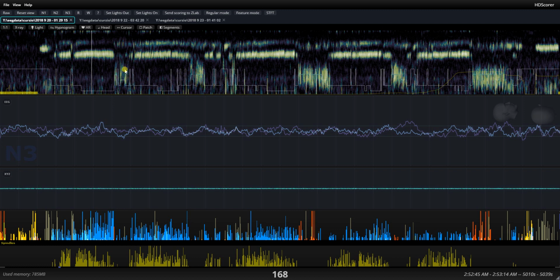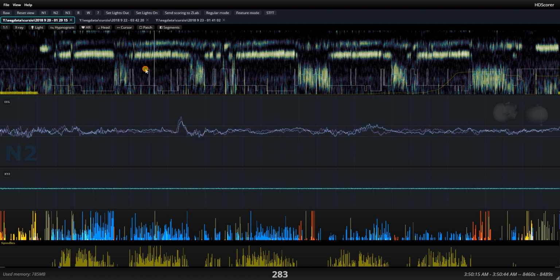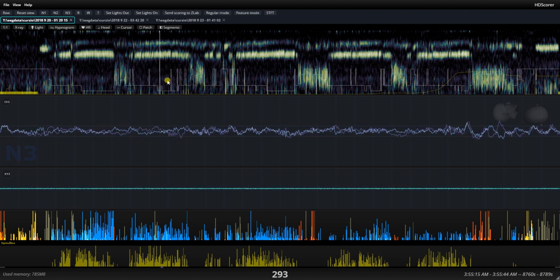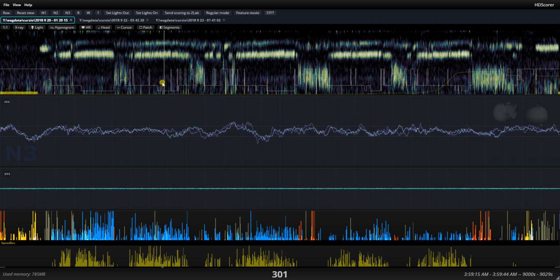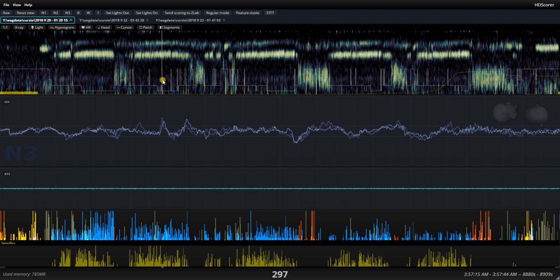For example, it's interesting here that in the second sleep cycle, when the sleep pressure should still be significant, I spent actually half of the cycle still in N2 sleep. So that might be mistaken, but I moved to it, and in fact I find that the signal is very flat, and I have K complexes, so it does make sense to score that as N2. However, here it goes into N3, so I want to check that that step is justified, and yes, I do see a lot more low frequency activity here than here. Perhaps not as big a difference as here to here, but that's to be expected as the night moves on.